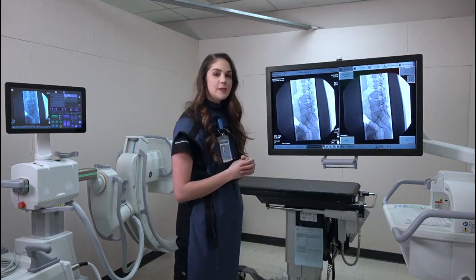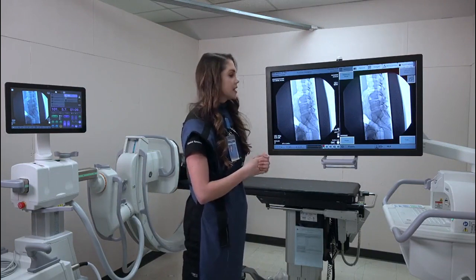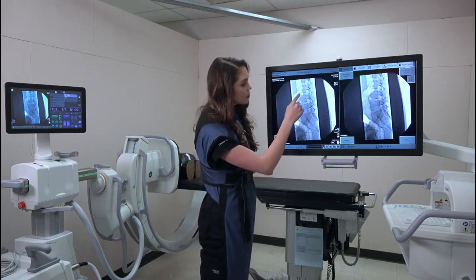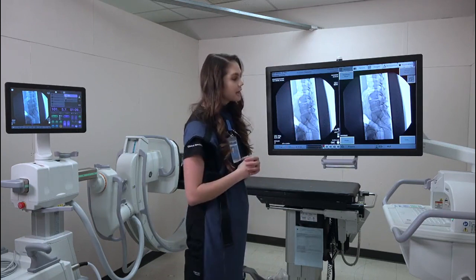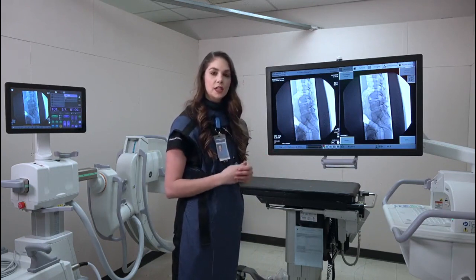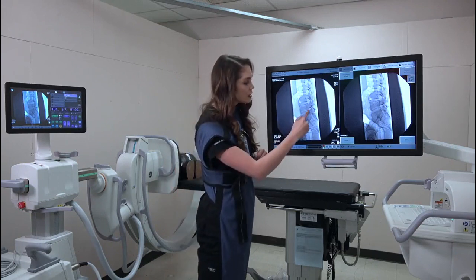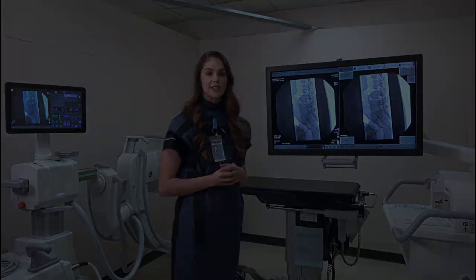In this position, we want to make sure that the lumbar vertebrae's body is in a true lateral. What we are looking for is a square. As you go up the spine, you'll notice a bit of shadowing or a half circle. This is showing that we are not in a perpendicular position, and we need to adjust the locks on the C-arm until we see that the lumbar body is in a true lateral square position.